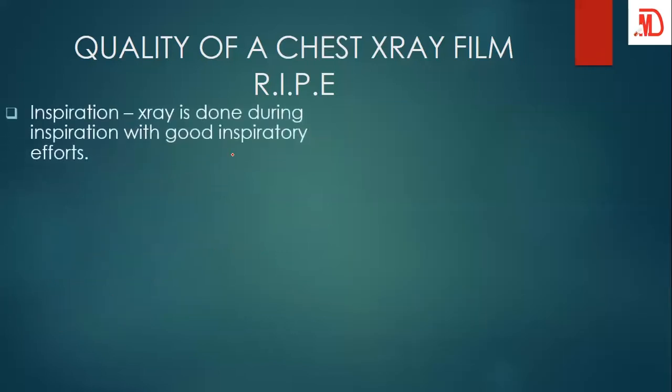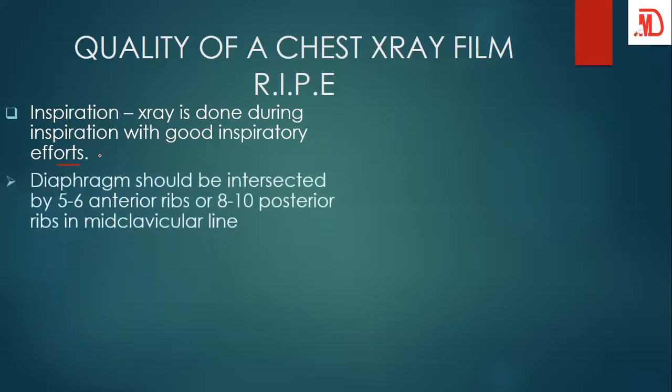So under inspiration, what is it? Normally an x-ray is done during inspiration with good inspiratory effort. So you have to breathe in, then we take it. As simple as that. It's very important to inspire very well before an x-ray is taken. Now, how do you know, because you're not there when the person was breathing in? As a clinician, or a radiologist, how will you know that indeed there was good inspiration? You use the number of ribs to help you.